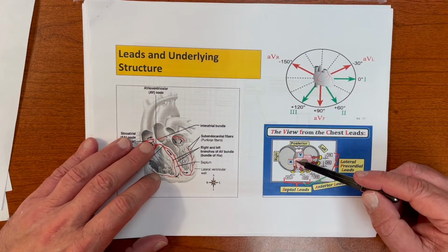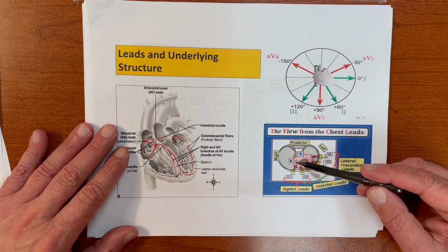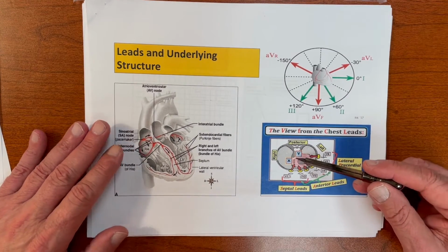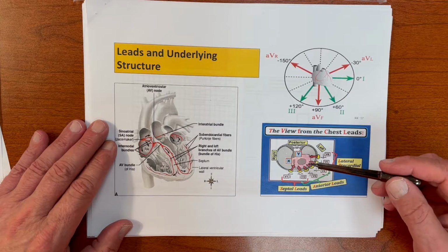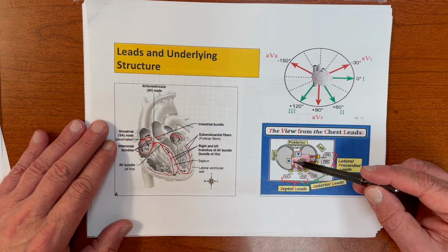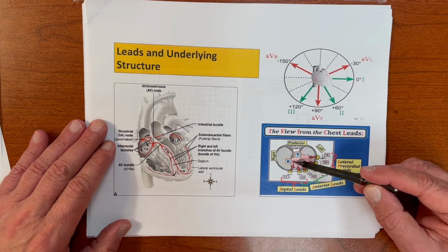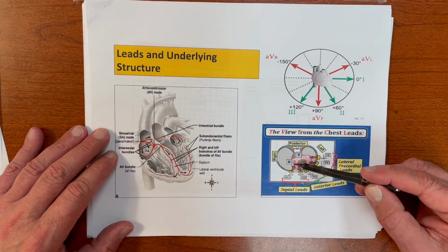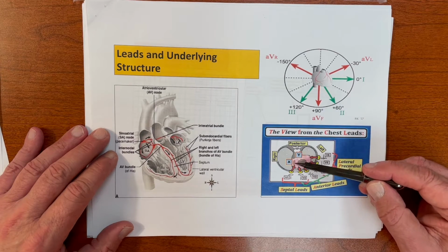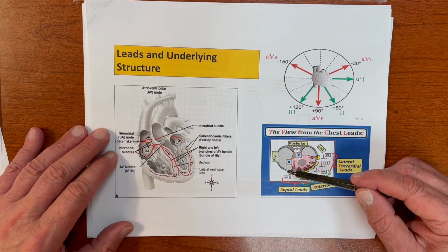Well, let's think of, let's say, pulmonary embolism. If somebody has a large submassive PE and they get immediate pulmonary hypertension and they dilate and blow out the right ventricle, the right ventricle will no longer be small like this or positioned like this. If it's under pressure, it's going to dilate. Well, what's it going to do? Is it going to push the sternum out of the way? No. Going to push the spine out of the way? No. Is it going to push the left ventricle out of the way? No. It's going to go one way, this way.